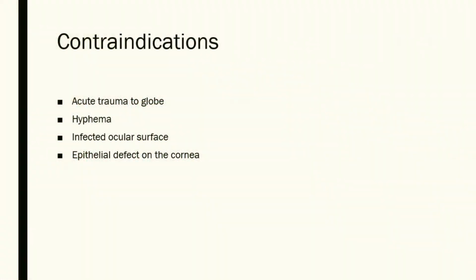So does anyone know the contraindications from that side maybe? Any infection. Okay, yes, surface infection. Okay. Very good. Oh, ma'am, in case there is a corneal defect, edema or endothelium. Corneal epithelial defect. Okay, good. Next. Yes, penetrating trauma. Yes. Okay. Open globe injuries. Then in hyphema. Why shouldn't you do it in hyphema? One, visualization. Okay, you can't see much. Otherwise, yes, most important, you can cause a rebleed.